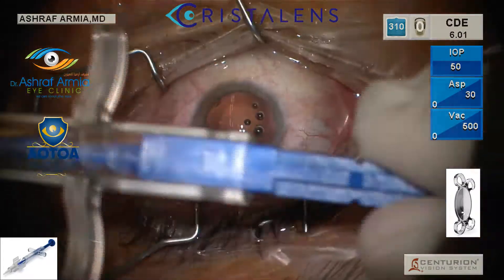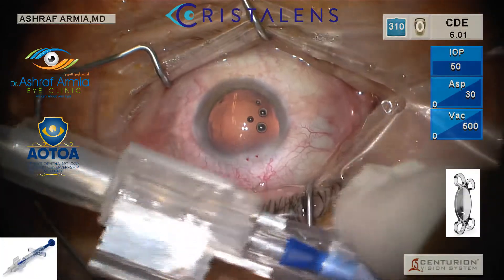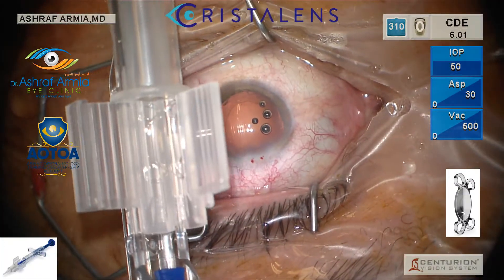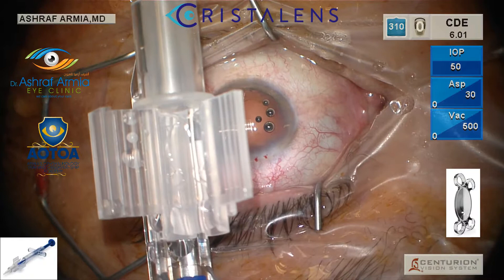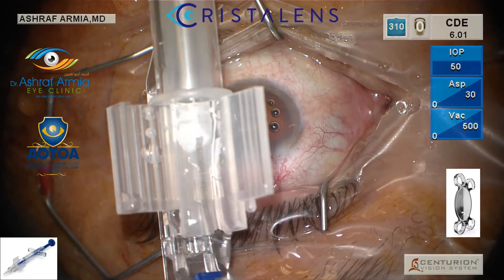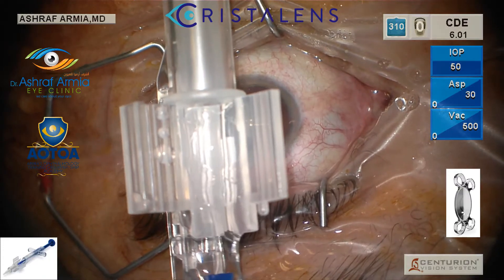With the pre-loaded IOL, you first remove the lock to open the cartridge. Then with the BSS you irrigate the IOL and the cartridge. After this, you put your viscoelastic above the IOL and inside the cartridge.